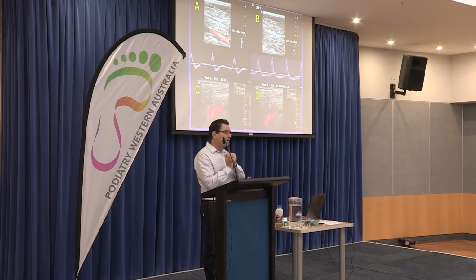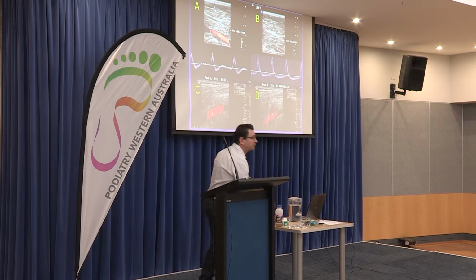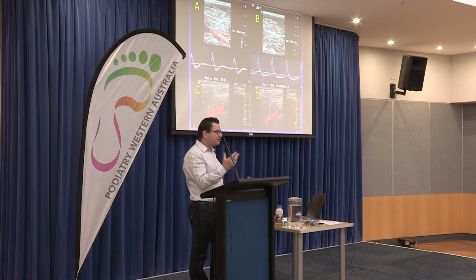So if you just use my bending, how much do you have to narrow off a garden hose to make the flow stop? So although you can see here on my images, just off the top of my head, I reckon it's still probably narrowing by about 20 to 30% in exercise, but it doesn't actually have any flow effect, and the person's symptoms had gone.